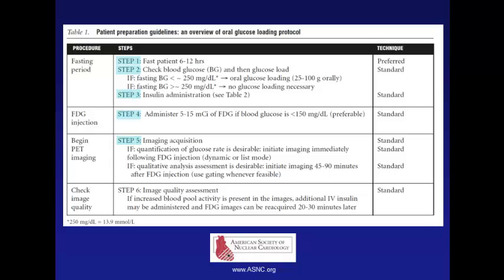But if the patient has been sent home and is on his way somewhere in the Alps with no cellular connection in my country, you're in a tunnel somewhere, nowhere, you're lost, because you have to come back and re-inject FDG. If you wait and look at the pictures, re-inject and scan, you can solve the problem in most of the cases.